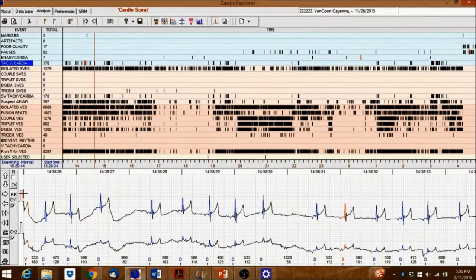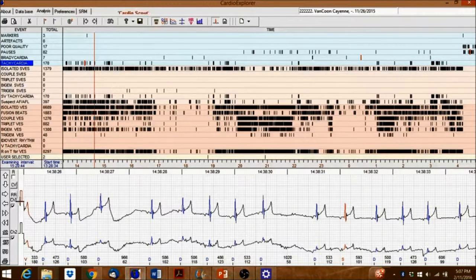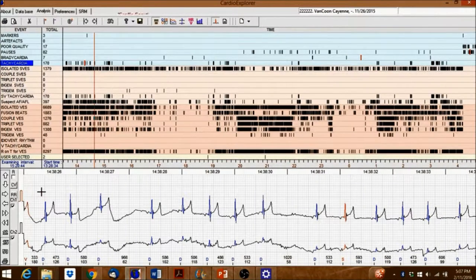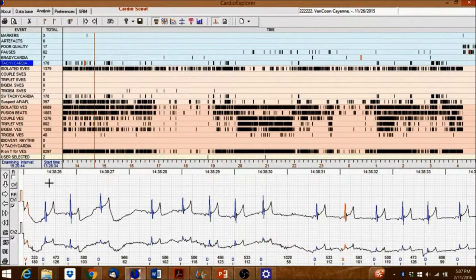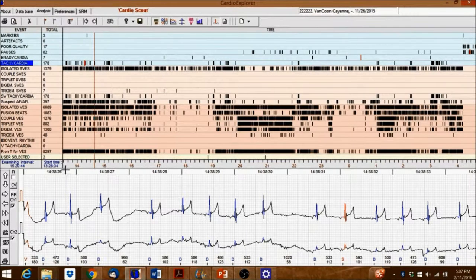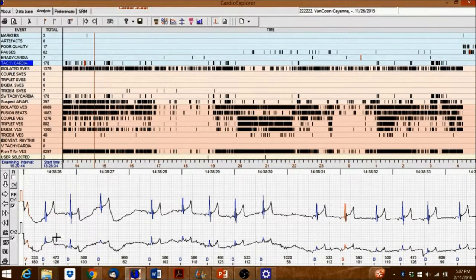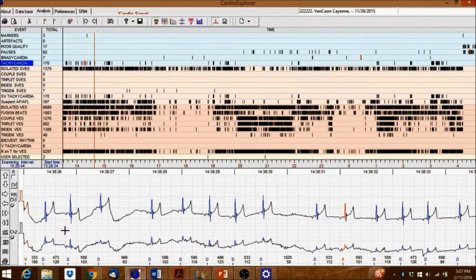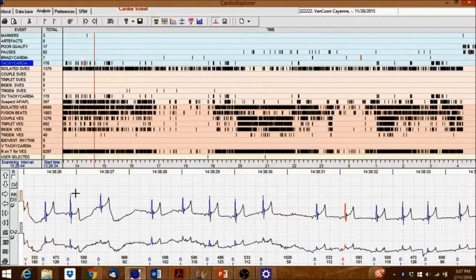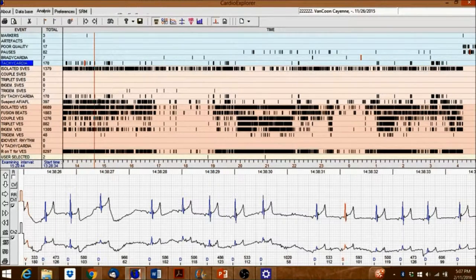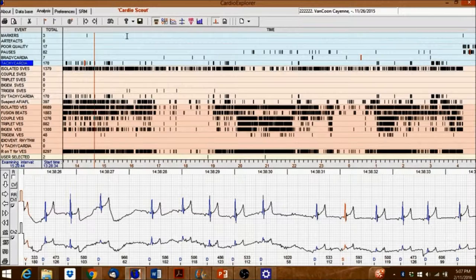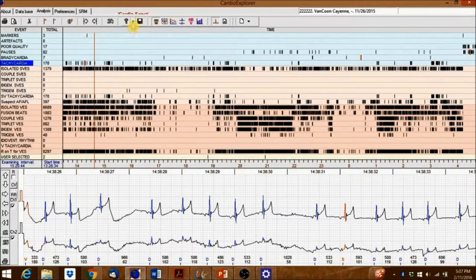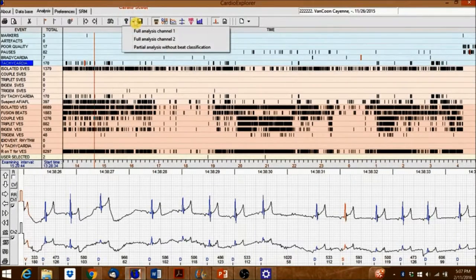The red highlighted calibration marker here indicates the channel that is currently being used for live analysis. If the channel seems too weak or not suitable for your analysis, click on the triangle icon left of the Save icon in the top menu bar, and select another channel to be used for analysis.